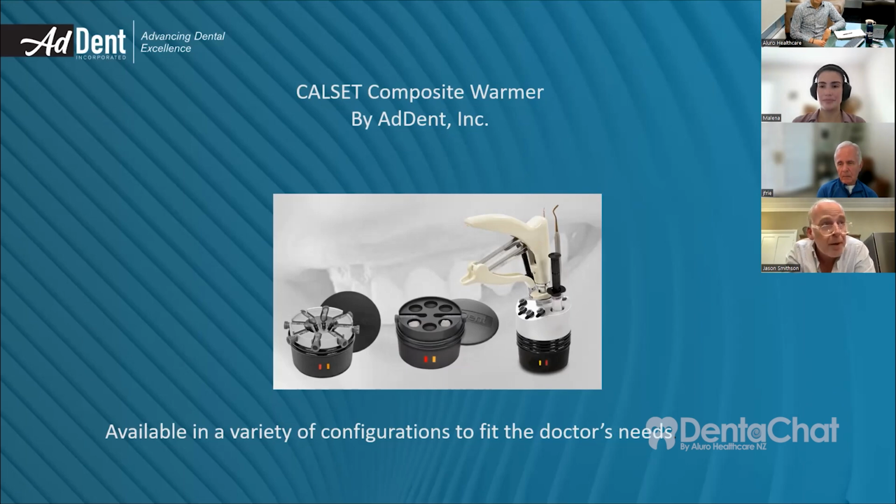So another reason why I might heat a packable, actually, I forgot to mention it when I was rambling on in the beginning, is on the facial surface when I'm doing resin veneers. If you use, for example, a brush and a modeling resin, which I do typically, if you heat the resin, you're going to get much better adaptability, I don't know if it's even a word, with your packable resin, and it's also going to polish better and have better mechanical properties in the end. So that's where I am on that. My answer to your question in the long run is no. I wouldn't heat a flowable.